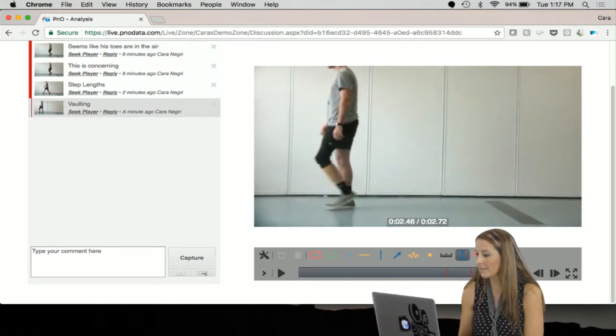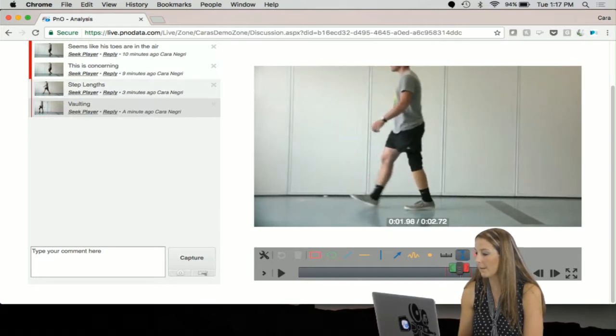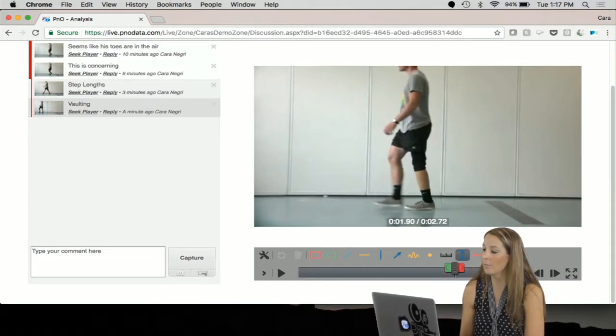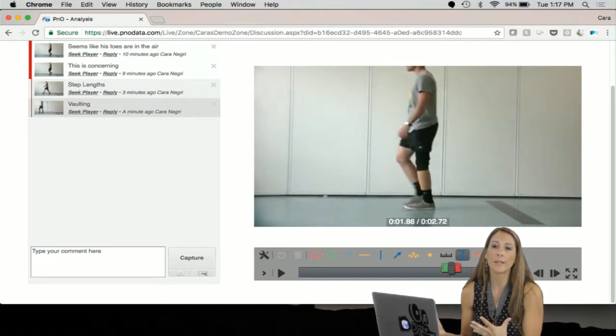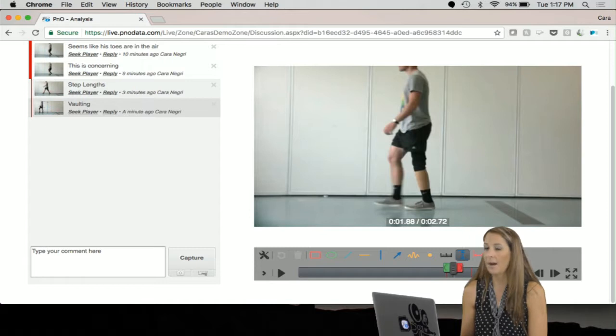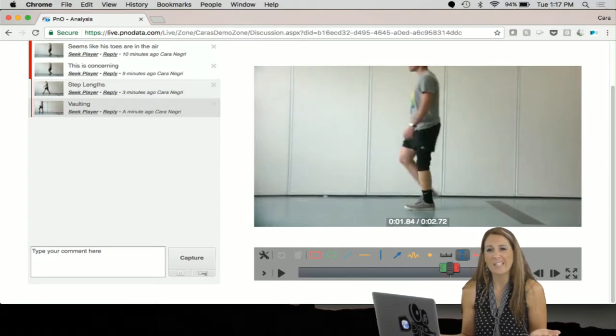Okay, so now we're going to take a look, and let's say that we want to look at the hip. So the hip I like to, well first actually we'll start with the ankle because that is one of the easiest ones. And we saw last week in the Edinburgh Visual Gait Score, or last month, sorry, that we want to look at maximum angles, but a lot of the times we know what we're looking for in gait, not in relation to maximum and minimum, but more so in the phase of gait and how that relates to an angle. So let's say that at mid stance we want to see around a 90-degree angle at the foot.